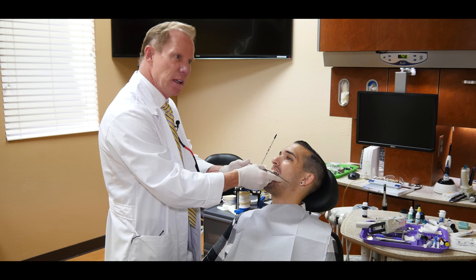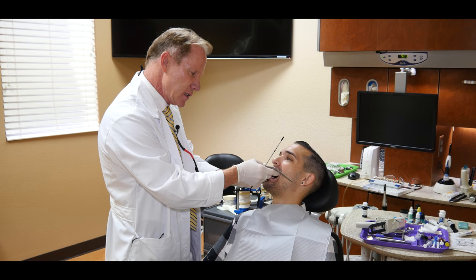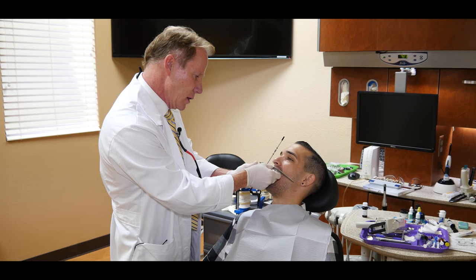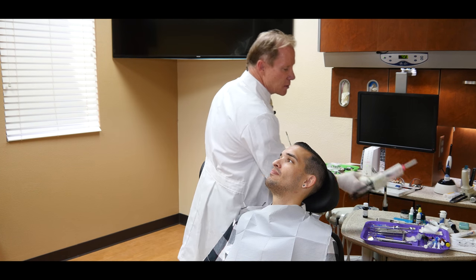Open for me. We leave the back of the plate out of occlusion. We put the front teeth against that plate, and then we're going to rotate this up until it's parallel to his horizontal plane. All right, so I'm going to use a bite registration material.